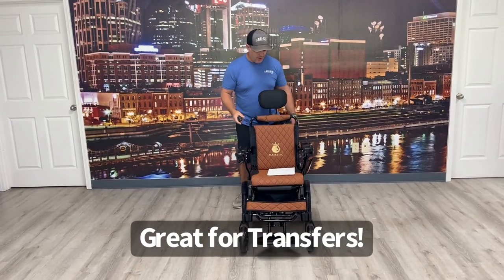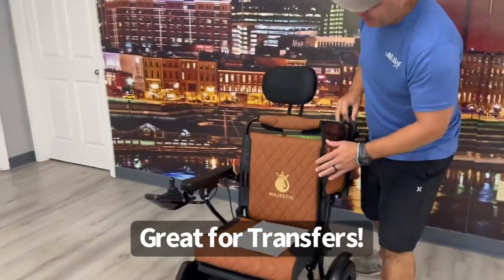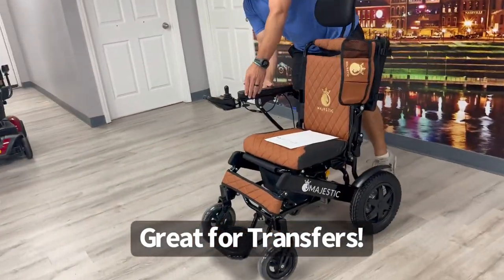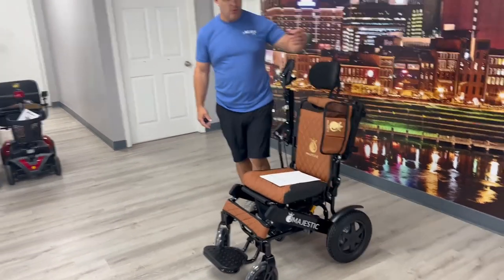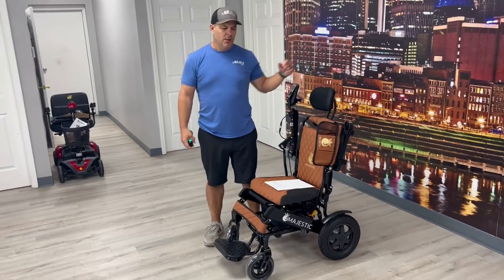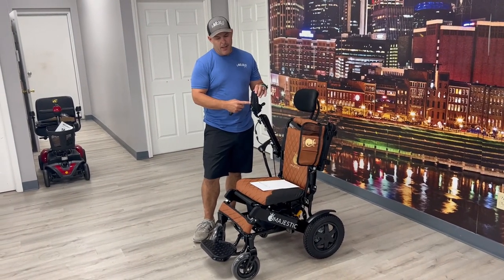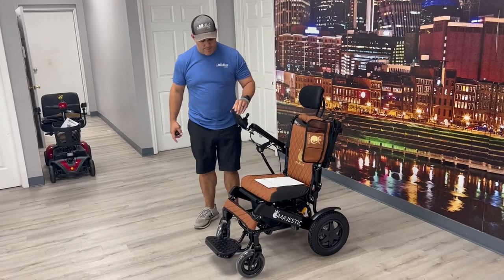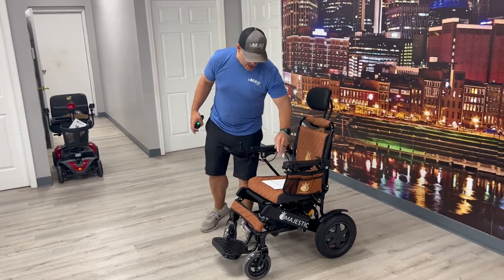You also have flip-up armrests. There's a button on the side that allows you to flip them up, so if you're needing to make a transfer you can do that. You can put the remote on the right or left hand side. The charger comes with it and you can charge it right here in the actual remote itself. The armrests flip right back down and they're very easy to deal with.